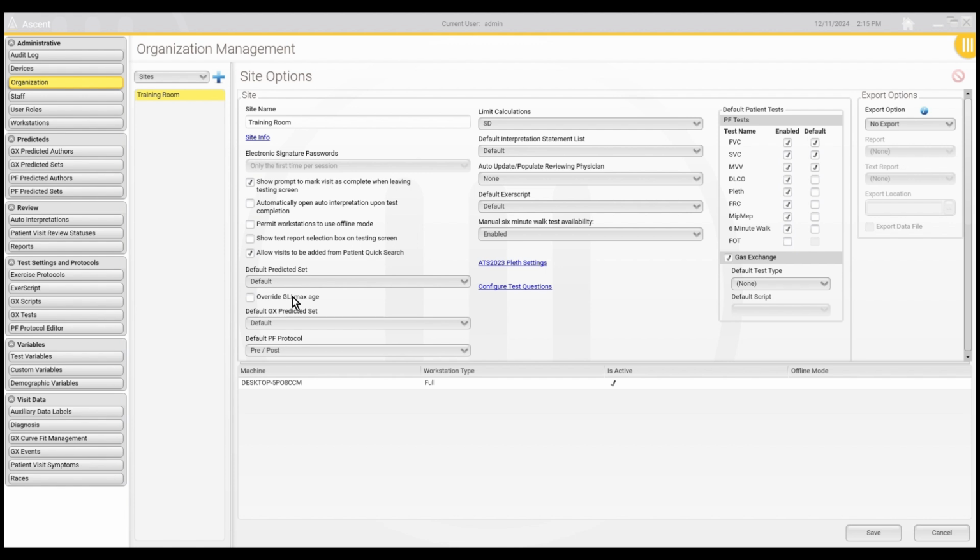Also, perform SVC maneuver is enabled. If the patient is unable to perform a slow vital capacity, this can be manually deselected. However, the SVC effort will be flagged as unacceptable. Repeatability will be set to FRC within 5% and will not be adjustable. Closed panting frequency must be greater than 30 and less than 60 if an obstruction is detected, or 90 if no obstruction is detected for acceptability.